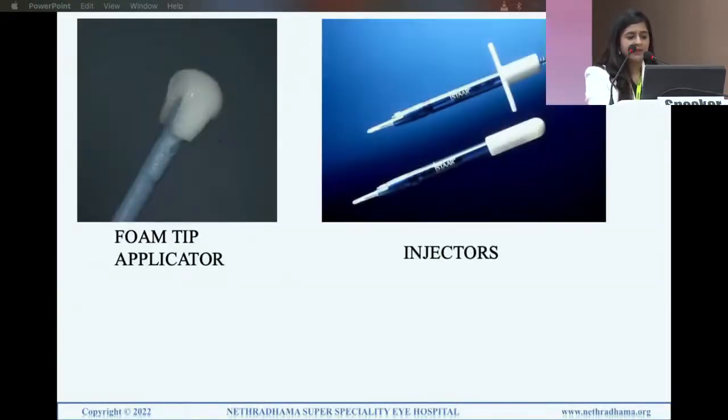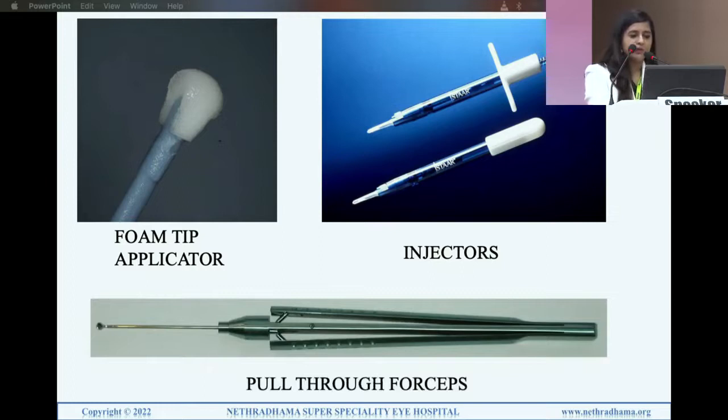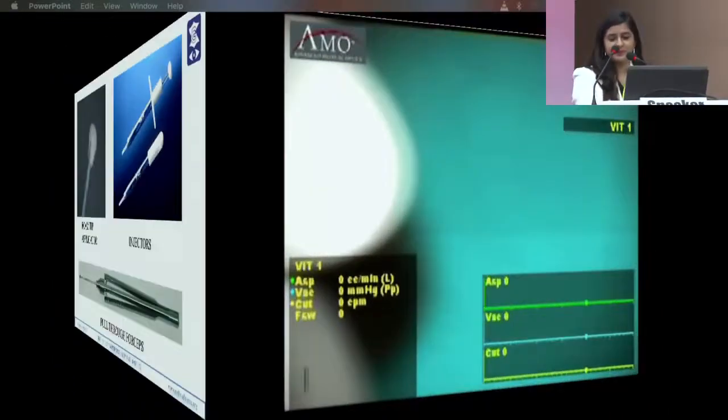So the other instruments, the foam tip applicator, the importance cannot be stressed enough. It has to be well hydrated to avoid overriding of the applicator, and the injectors are required, and the pull through forceps or the alligator forceps.